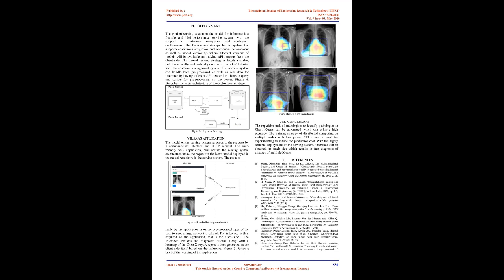Training strategy. Training of a deep convolutional neural network is itself a complex task and requires high computational resources. The experiments range from the training of the model of 16 layers to 201 on more than 100,000 images. This highly computational task can be achieved by distributed training of the model on multiple low-power GPUs on multiple nodes at disposal, to save the cost of training on high-end hardware.